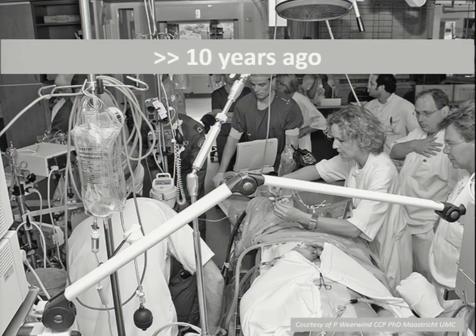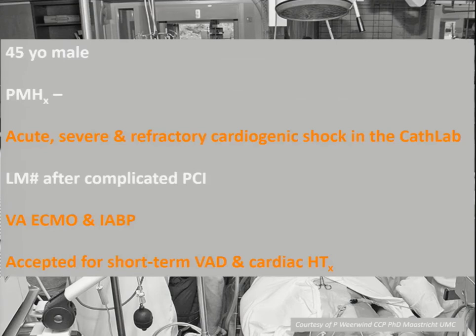And I tell you the story just to show you what ECMO was like 10 years ago and what you can achieve with ECMO. This was a 45-year-old male with actually no past medical history. He complained about anginal complaints, and he was catheterized diagnostically. Then the catheterization was complicated by acute, severe, refractory cardiogenic shock in the cath lab, since they produced a left main dissection.